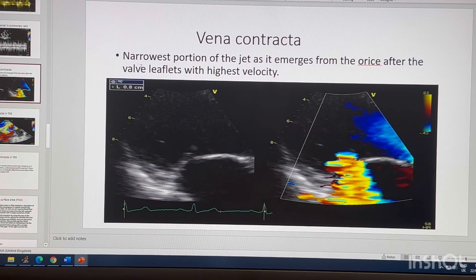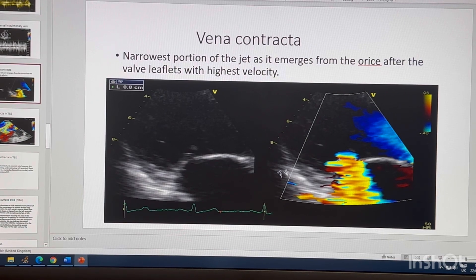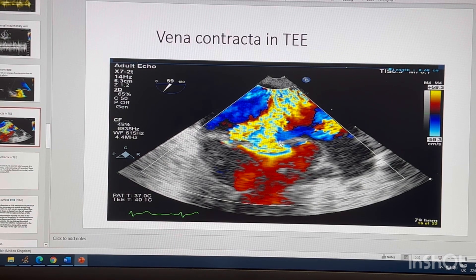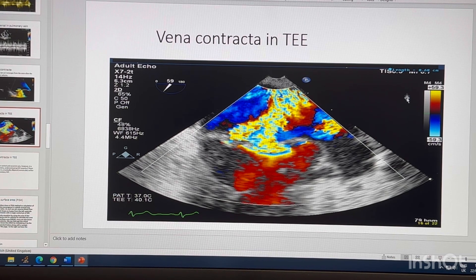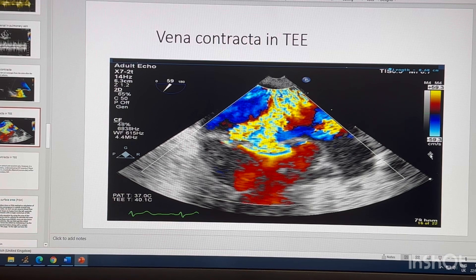Now moving to the presentation. Vena contracta is the narrowest portion of the jet as it emerges from the orifice after the valve leaflets, with the highest velocity. On this TOE image, you can see the leaflets co-opting and the narrowest portion just after them — that is where you measure it. You should not change the color baseline or scale. A common mistake is adjusting the baseline for vena contracta the same way as for PISA — don't do that, it will cause overestimation.